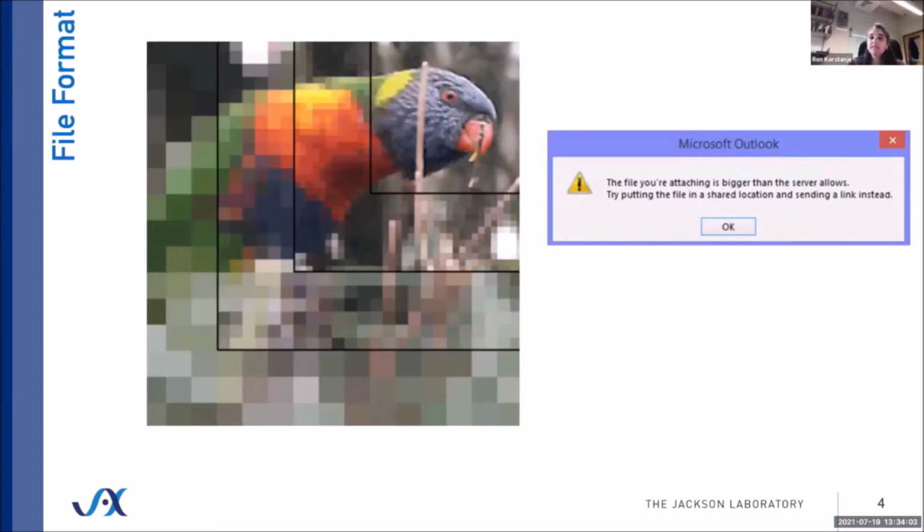This is important because of the advances in microscopes, which allow us to get whole slide scans at high resolution. Many of us along the way have taken an image similar to the example here, where we wanted to zoom in for more detail, only to find that it's become pixelated. Or we've tried to email a file to a friend or collaborator and get a mailer daemon message. There are solutions to both of these problems by taking either a large number of higher resolution images or breaking up our data into multiple messages to email them, but neither of those are ideal.